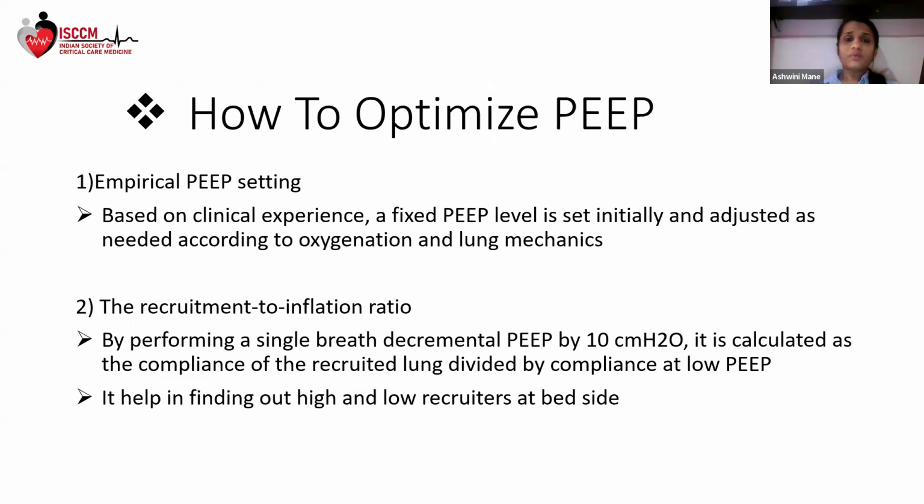Now the next question is, what is this optimum PEEP and how to set it, and what are the methods of optimizing PEEP? The first is empirical PEEP setting. It is entirely based on our clinical experience. First we'll set the PEEP and then we'll adjust it according to the oxygenation and the lung mechanics.